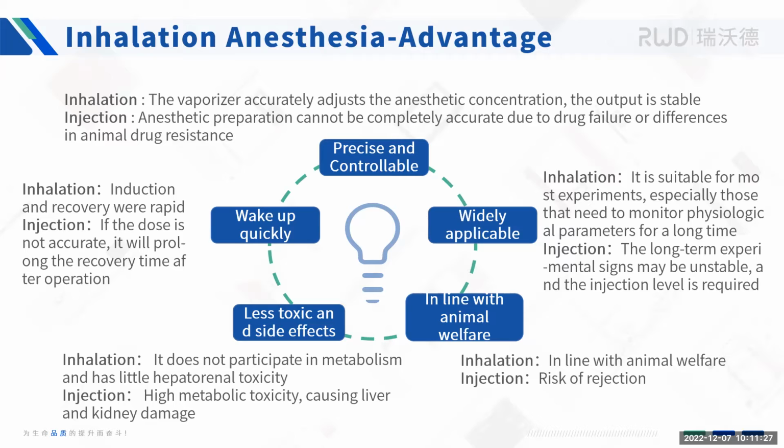And because of this characteristic, the animal can wake up in time. If we do the injection anesthesia, the recovery time may be prolonged due to the overdose. And the application range is also very wide. So it is suitable for lots of long-term experiments.